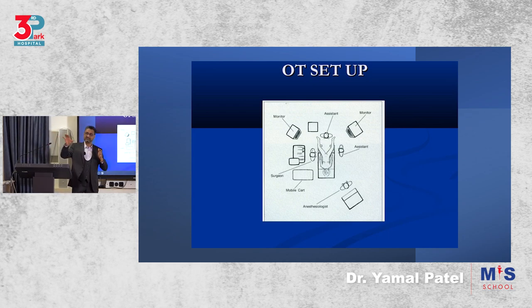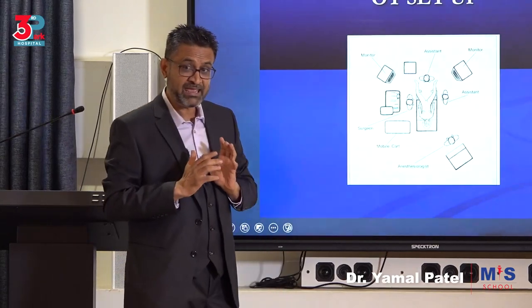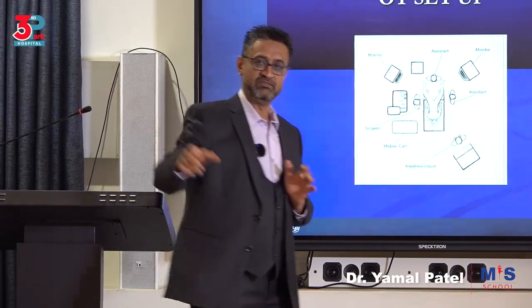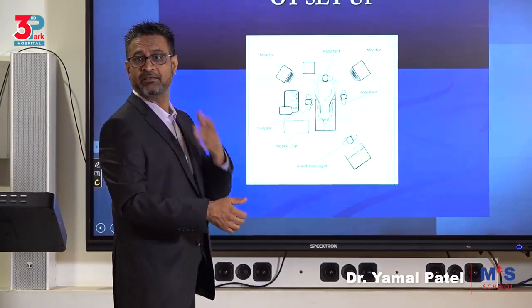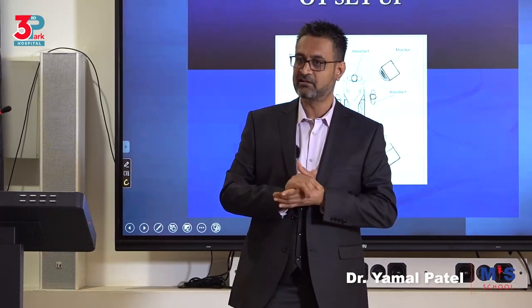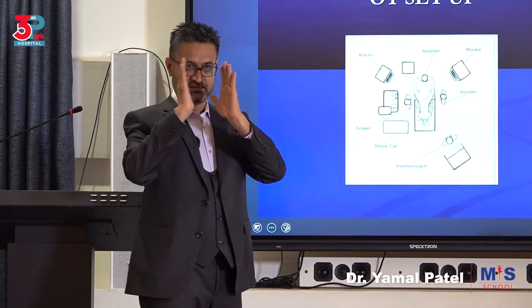We have ideally two monitors, one facing the surgeon, one facing the assistant. If you have one only, then try and bring it between the legs so that you don't leave it on the side of the surgeon, because I am the surgeon, so I should see. What about this other person? What will they have to do? You get what I'm saying? You do this for 15 minutes and your neck is gone. And trust me, you'll forever curse that surgeon for giving you a neck issue. So try and be considerate. Have that one screen put in the middle so both of you are seeing at an angle.